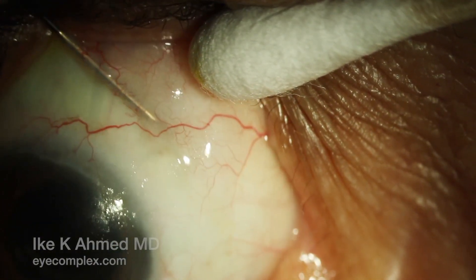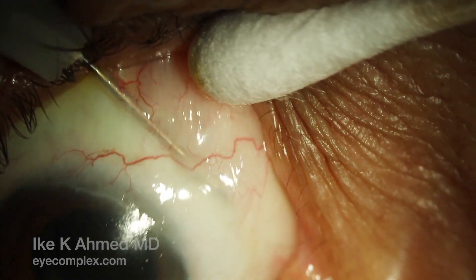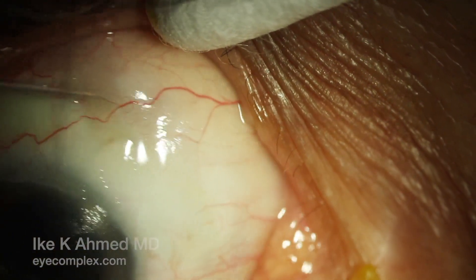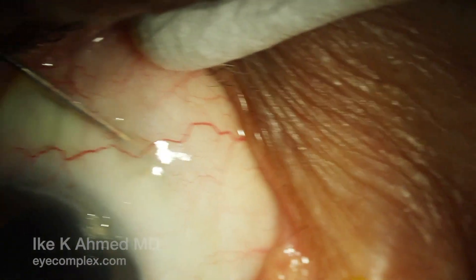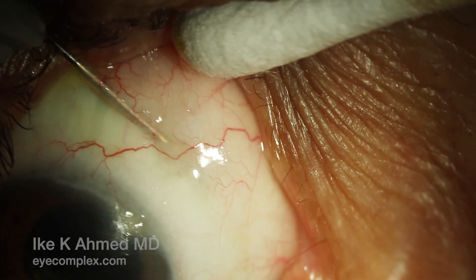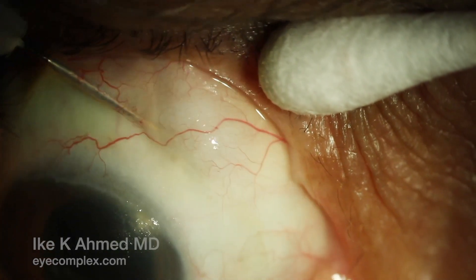The needle is also placed above the implant just under the conjunctiva to again release any fibrotic tissue overlying the implant as well. These underpass and overpass maneuvers — sliding the needle above and under the implant while sweeping toward the fornix — allow for freedom of the implant. The implant is now more free and moves as well.